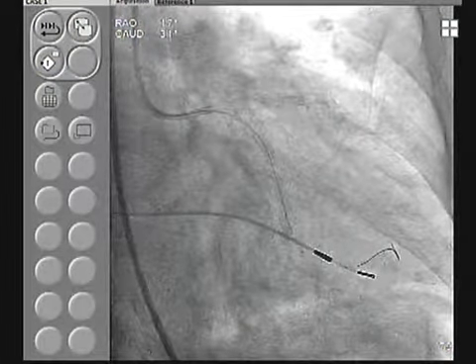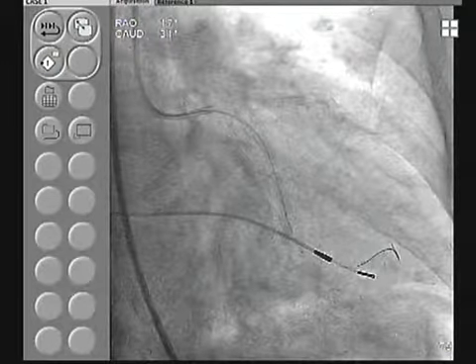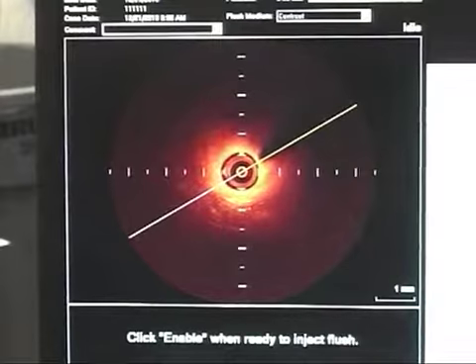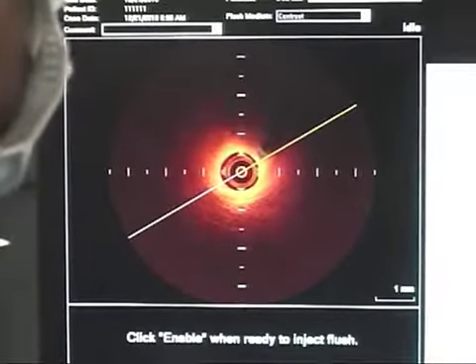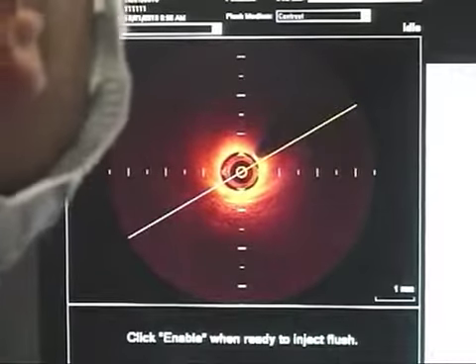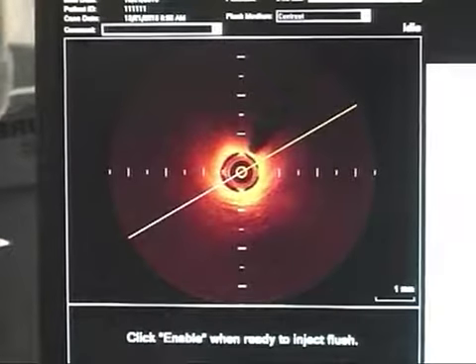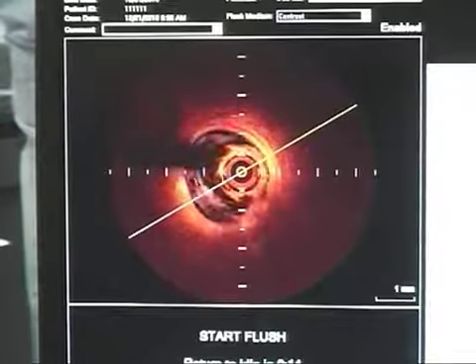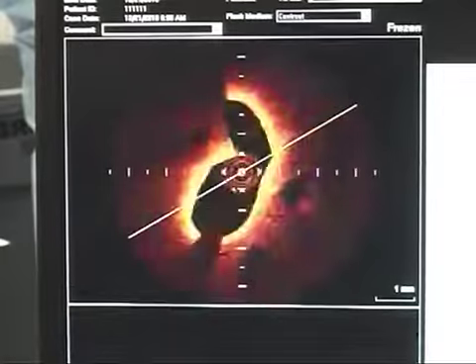Yeah. And Samin, a very important question is going to come here, which truly is one of the most practical teaching points. I pose this question both to Anu and to you: follow-up of this patient. This kind of patient, with the left main and still some complex cases, you can do angiographic follow-up, but this kind of patient we will do clinical follow-up. So at what time period would you do it? Okay, let's concentrate on the OCT.